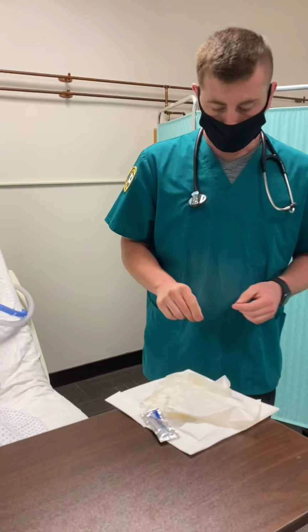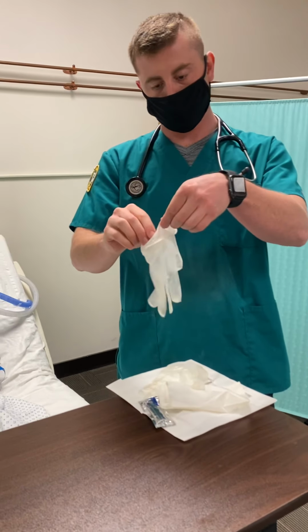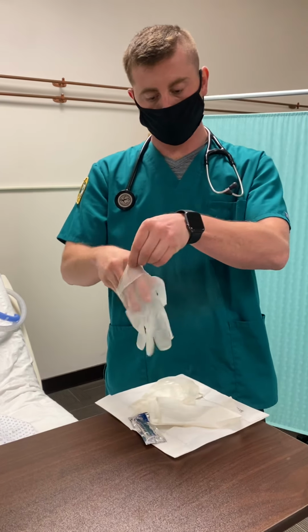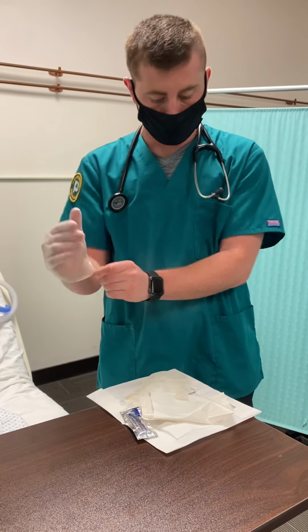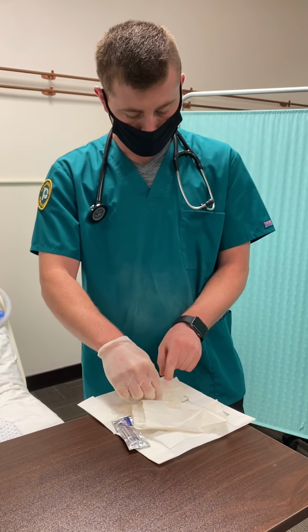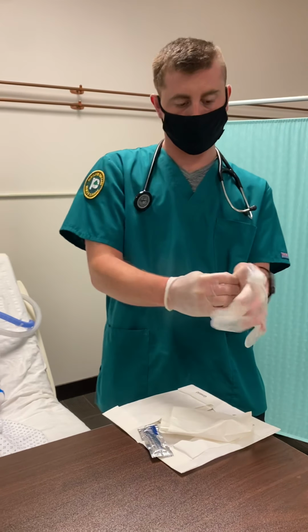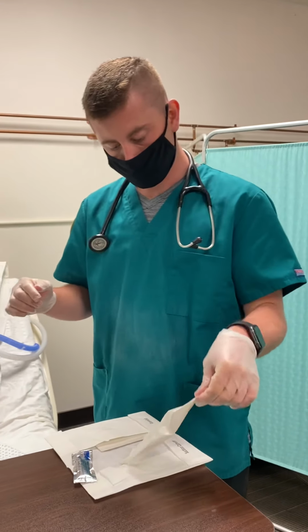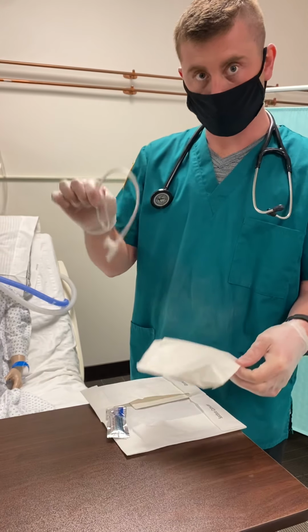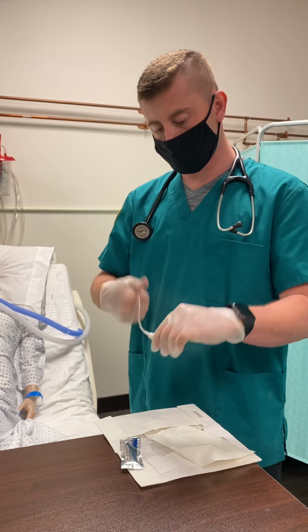Next, I will don the gloves. Once the gloves are on, my left hand will be my dirty hand and my right hand will be the sterile hand. Alright, we're going to take you off the vent real quick, and we'll get your SpO2 up to 100%.